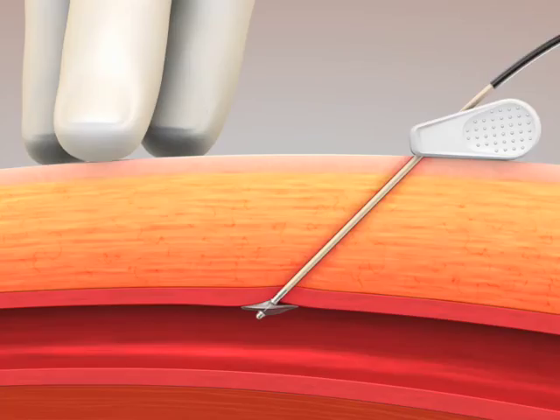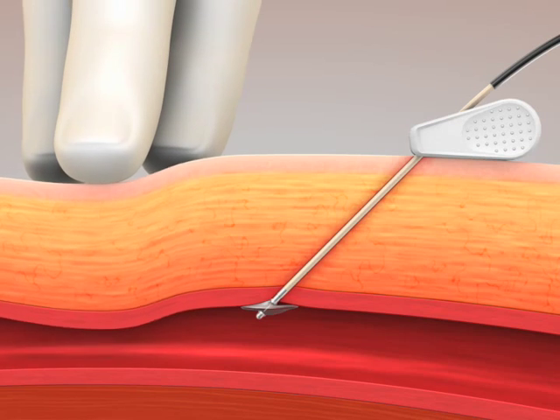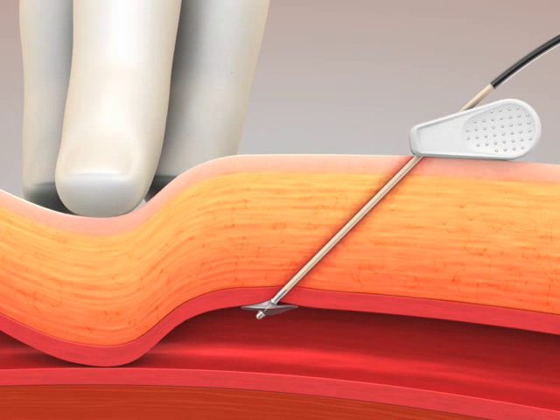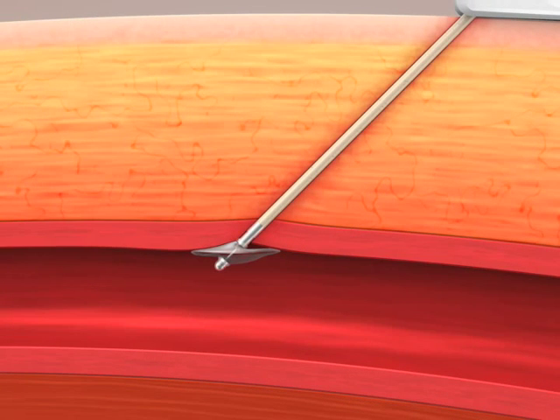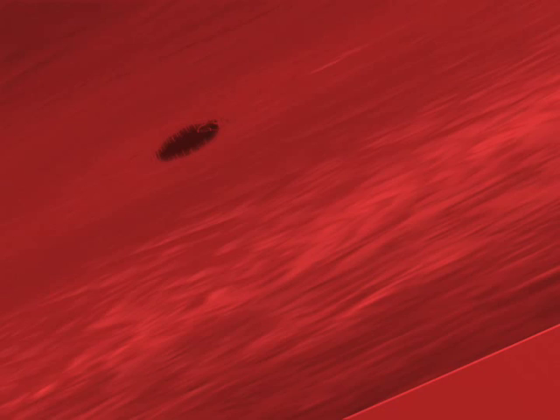Prior to removal, the artery is located proximal, superior to the catalyst clip. Apply and maintain occlusive pressure to the artery. To remove the device, the disc is collapsed and the device removed by gently depressing the actuator.